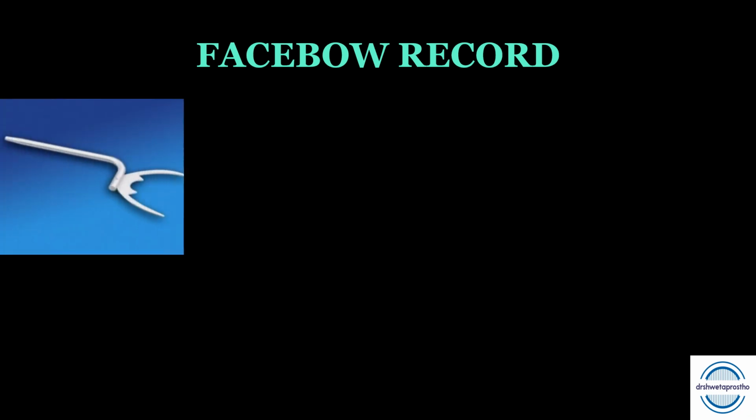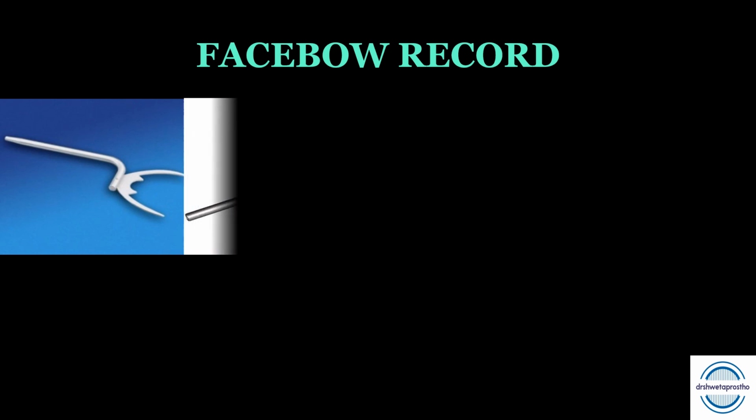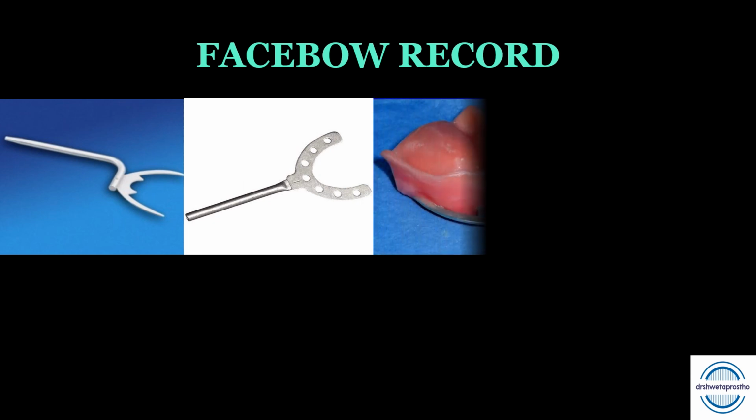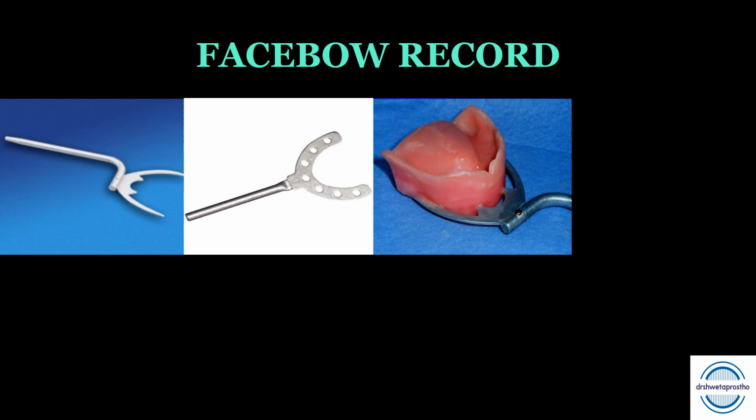Facebow record. How to do the Facebow record and transfer it to the articulator. Now this is the bite fork of the edentulous with the sharp ends and the other bite fork for the dentulous. We will insert the bite fork in the occlusal rims 2 mm above the occlusal plane so that the plane is not distorted. Then we can use impression compound for the dentulous.